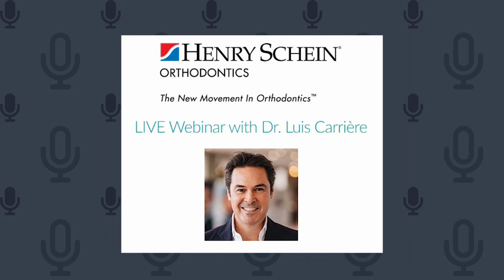I find the use of lower molar bite turbos for adult cases actually more comfortable for some patients, especially for joint discomfort. And in class 3 cases, some of my adults experience joint discomfort after a few weeks. Have you seen this as well?